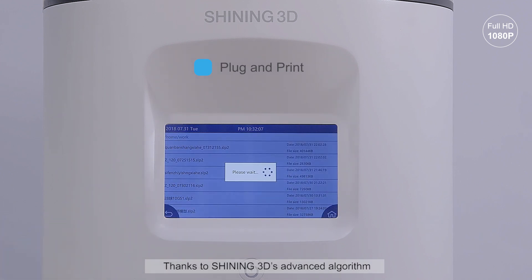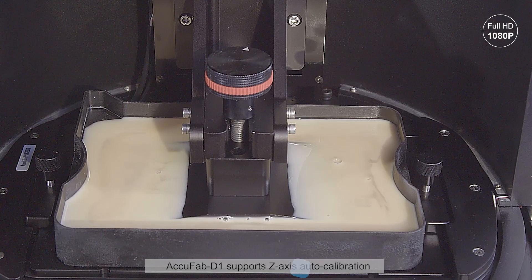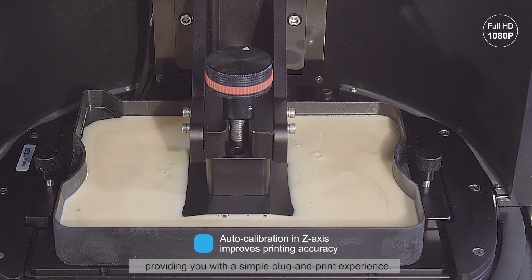Thanks to Shining3D's advanced algorithm, AccuFab D1 supports Z-axis auto-calibration, providing you with a simple plug-and-print experience.